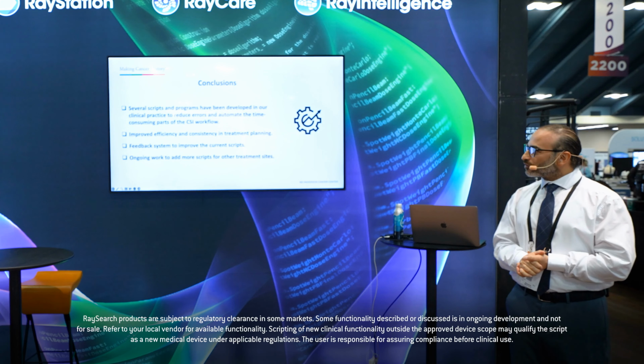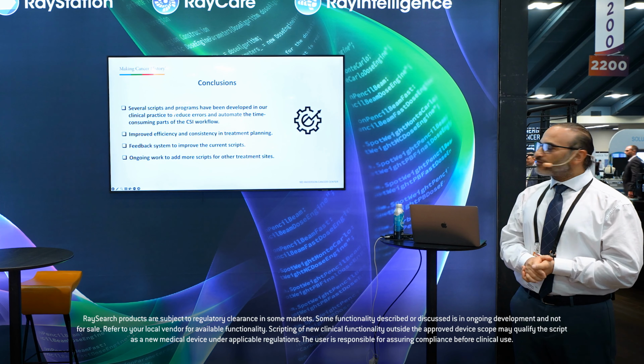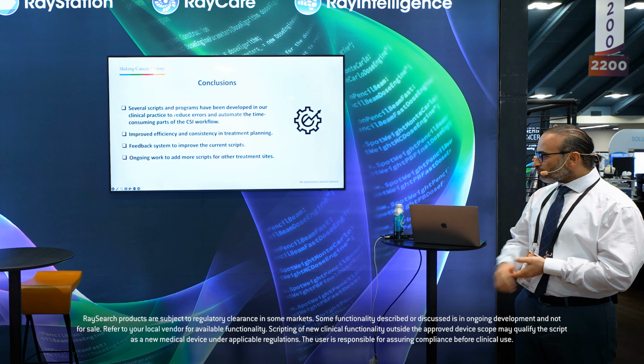So that is very important to mention here. So we have an improved efficiency and we have consistent plans.